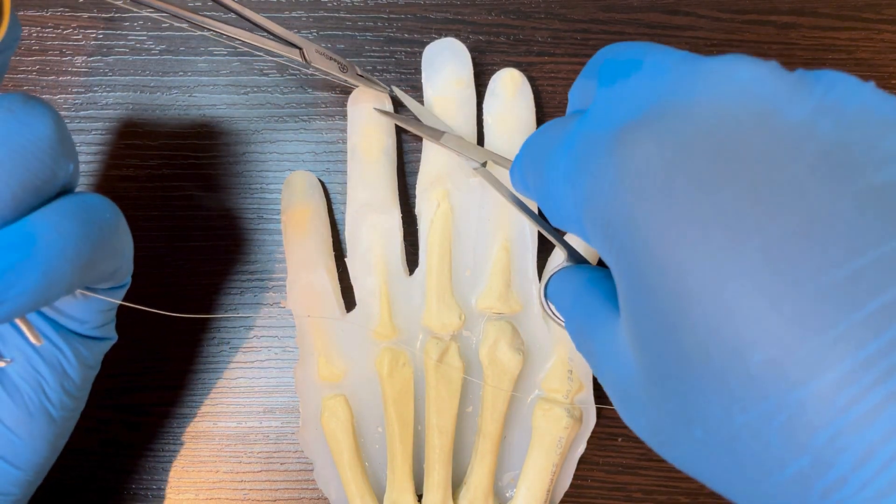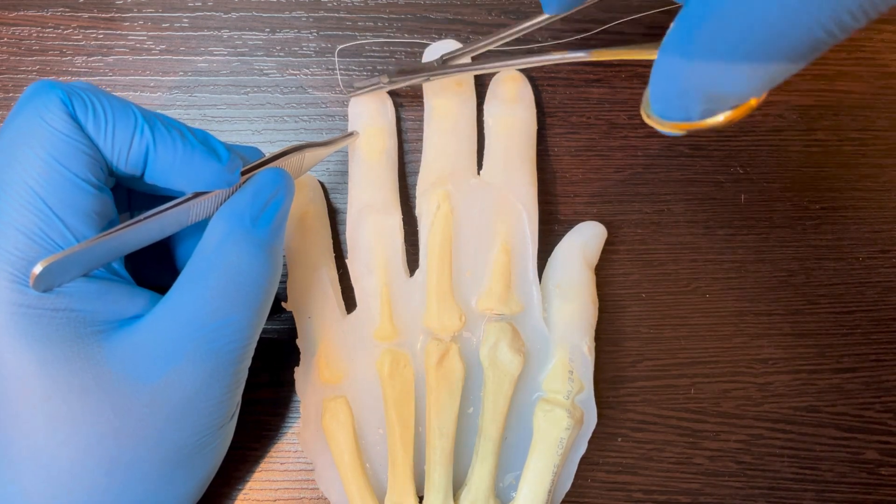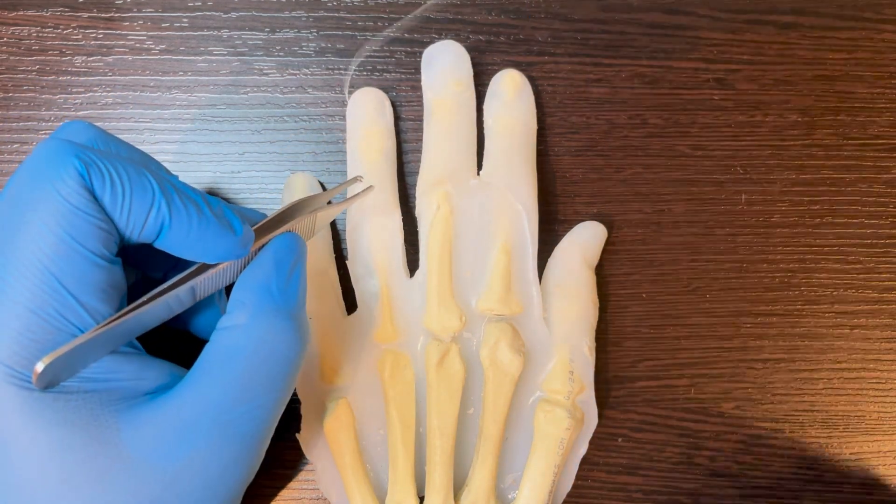You don't need to suture the underlying fat or neurovascular bundles. Now do the exact same thing on the other perinychial fold.